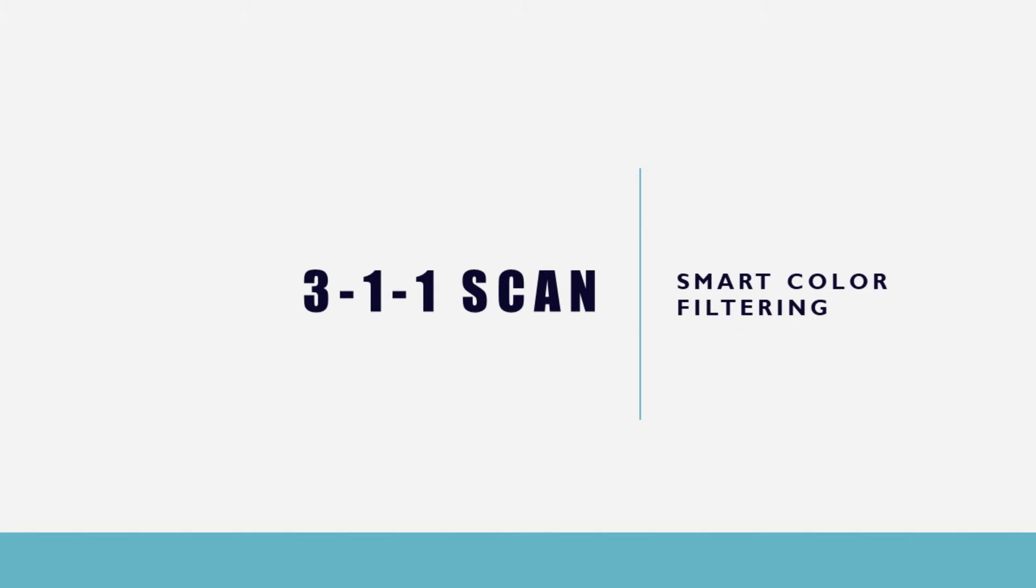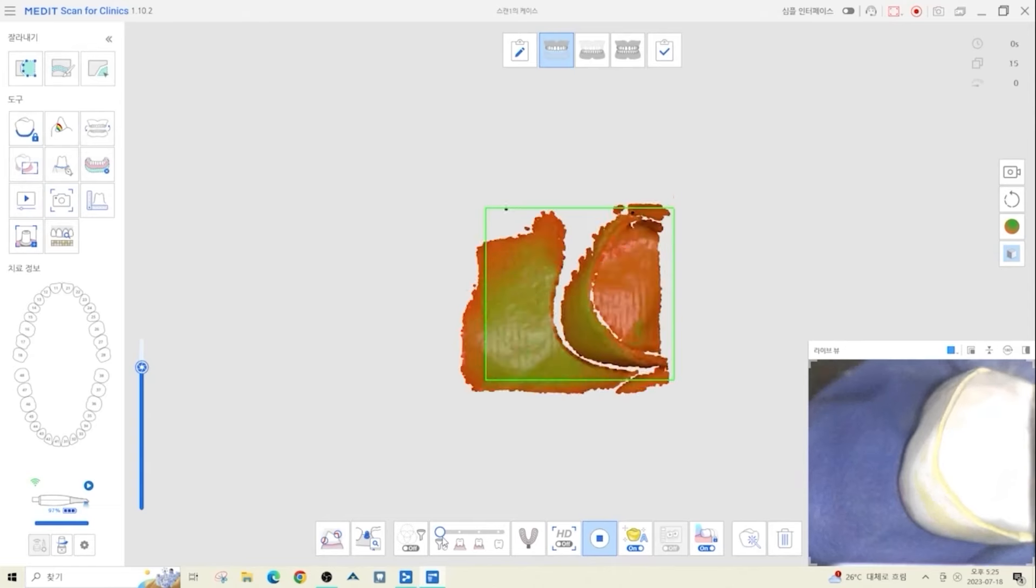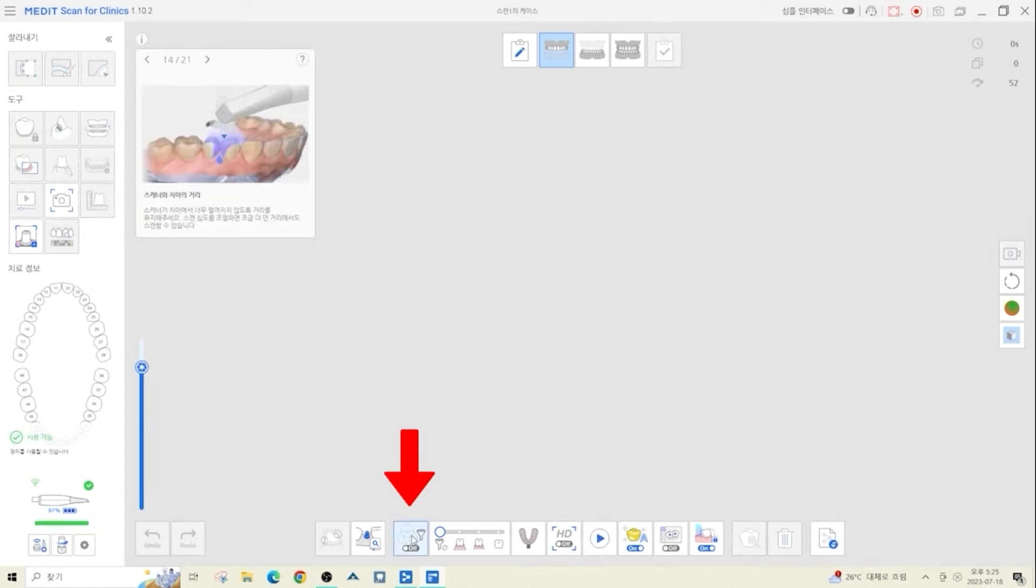One feature that the Medit scanner has is smart color filtering, which allows you to scan only the crown cleanly. We're going to register the color of the gloves with smart color filtering and scan the crown while holding it with a gloved hand.